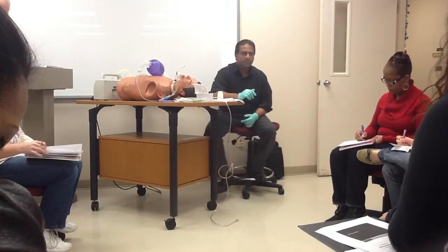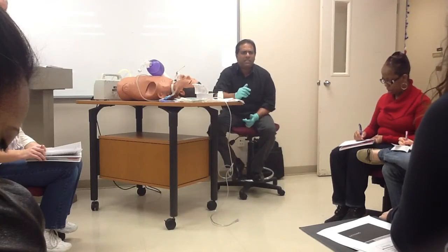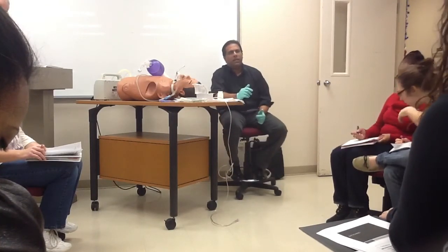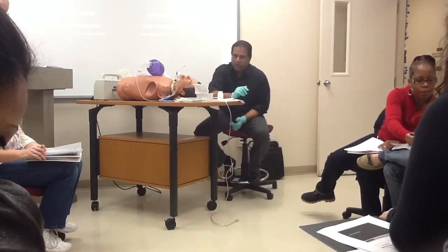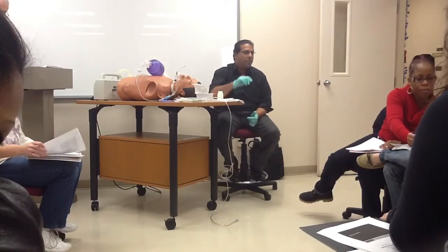Do they think they're there? I guess they do. 8 is normal for adult patients, all of our adults are 8s. I'm talking about the trach size, not the catheter size. Yeah, 8 is the norm. Oh, see, I'm used to kids. So it's divided by 2, times 3, plus 2.